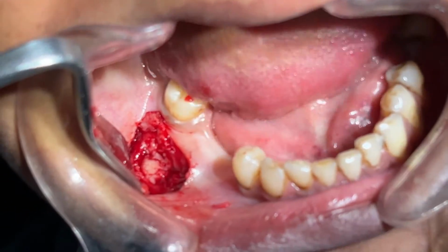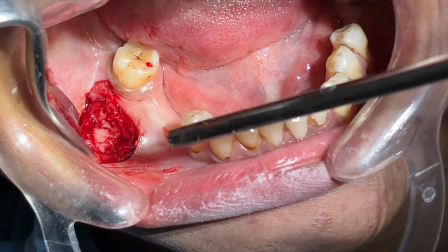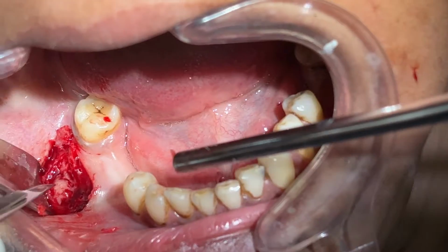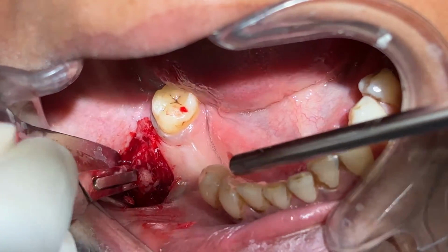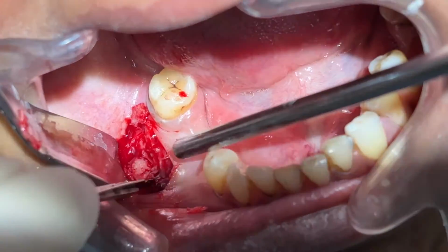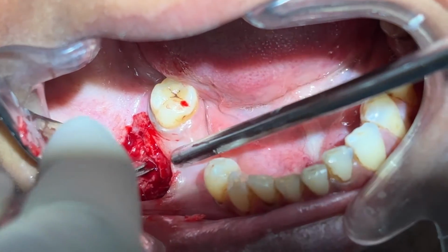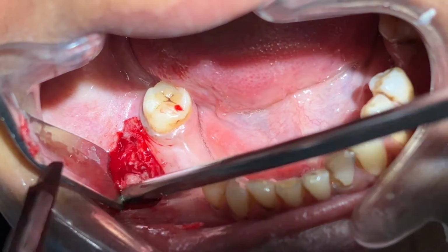Now I will use my number 15 blade and a tooth forceps. I am giving the incision here, like this. This is one incision, and another is like this. I prefer to take a good chunk of tissue for the pathologist.